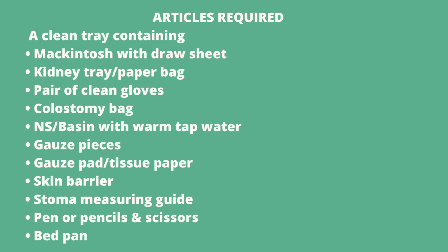Okay, after that we need a bedpan also. During that colostomy care procedure, we need to remove the waste product like fecal matter before attaching the colostomy bag. So we need also a bedpan for that purpose.